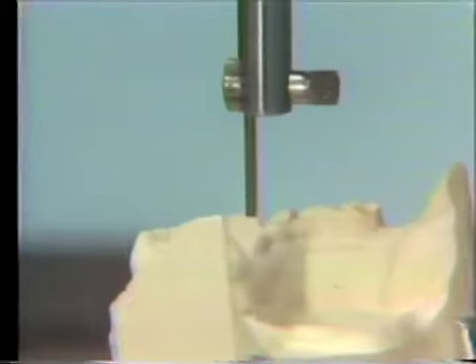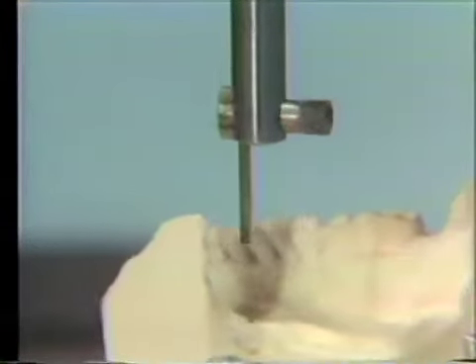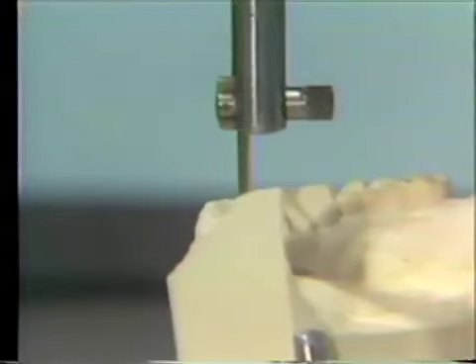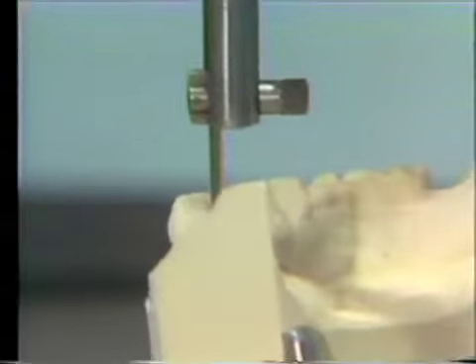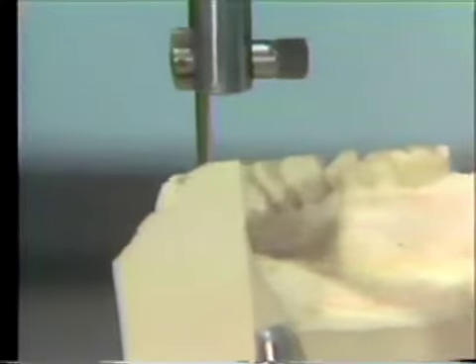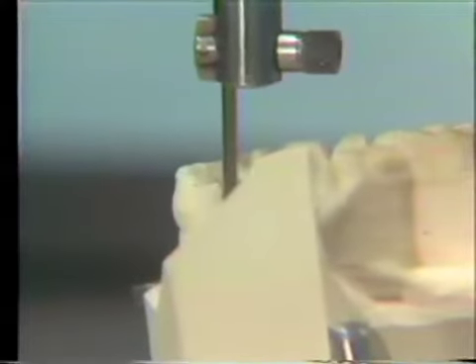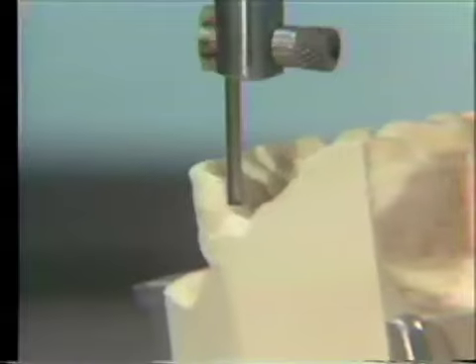Now I can go around my diagnostic cast and mark where the heights of contour are, and we'll start on the potential abutment teeth, and I'm going to mark the lingual surface. It may be necessary to raise and lower the analyzing rod as we go along so that the base of it does not touch the cast.